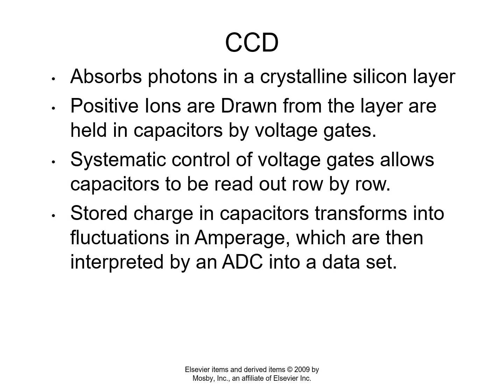So that's how the CCD is capturing the light, so to speak: the silicon is shedding. When the silicon is hit by light energy, it sheds its valence electrons. Those would ground back out into the silicon, but before they can do that, they're pulled away by this anti-static layer. Okay, so as the silicon absorbs light, it becomes effectively positively charged. Now, if you have the underside of the silicon coupled to capacitors, then those positive charges will drift down onto the capacitors. Okay. The positive charges will drift until they find electrons. And so you have to kind of trick those positive ions into staying on the capacitors, and that becomes clear when we look at the schematic on the next slide.